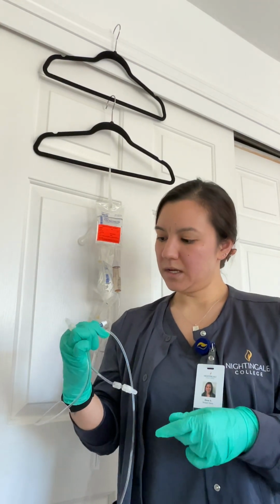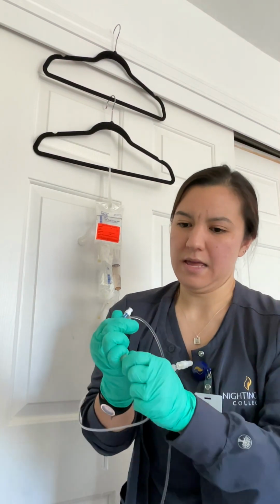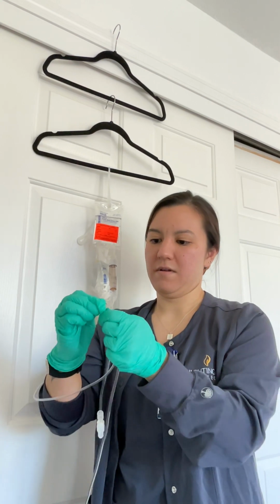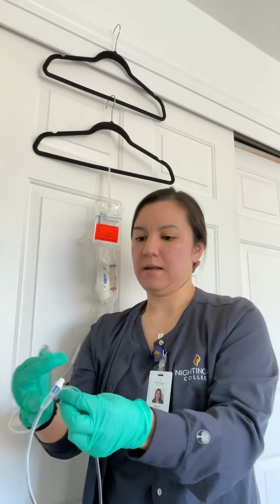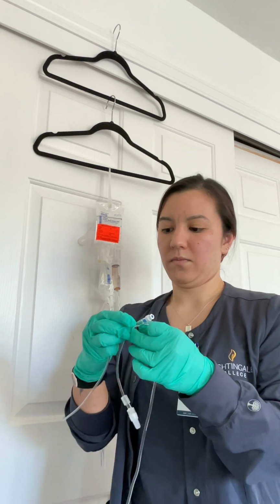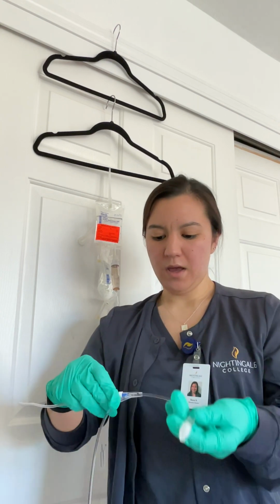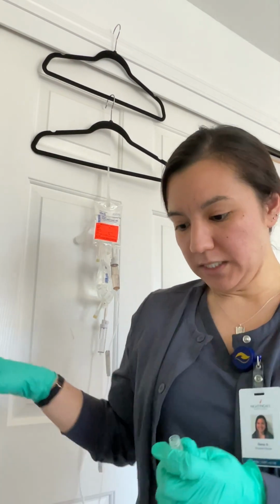All right, so once that's dry, we're going to take our piggyback adapter end and attach it to our Y port, screwing it in.